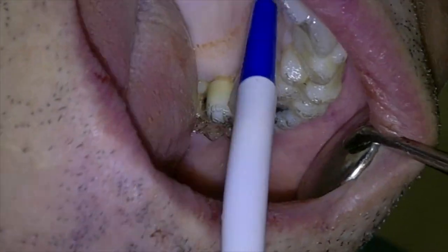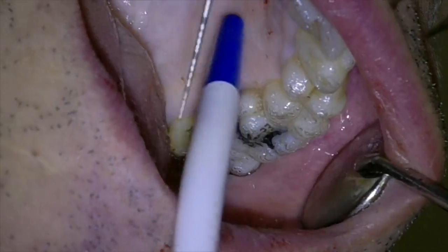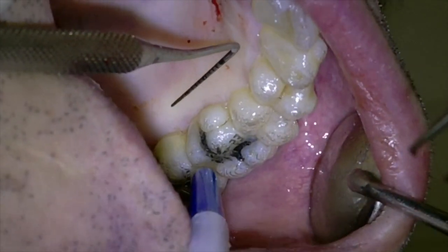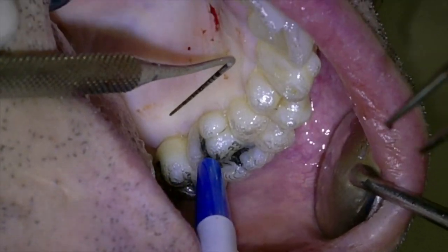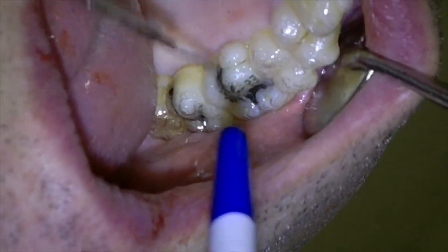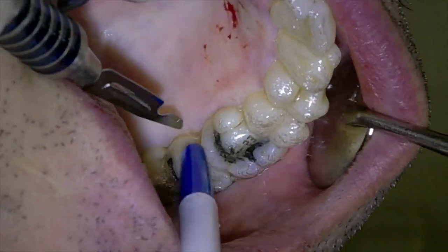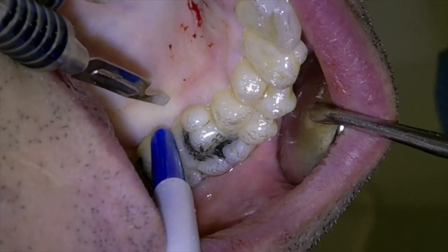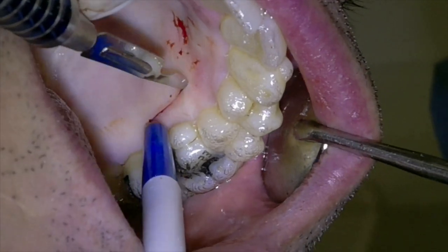So I'm going to grab the area that I showed you in the masterclass, which is basically I'm going to take about 15 millimeters of connective tissue graft. This palatal area is the most predictable one in terms of visibility, surgical access. And basically, I'm going to start with my horizontal line, about 3-4 millimeters from gingival margin level.